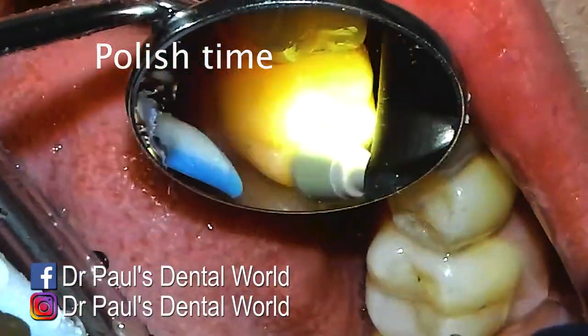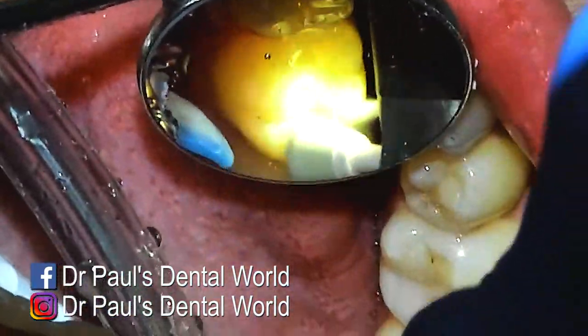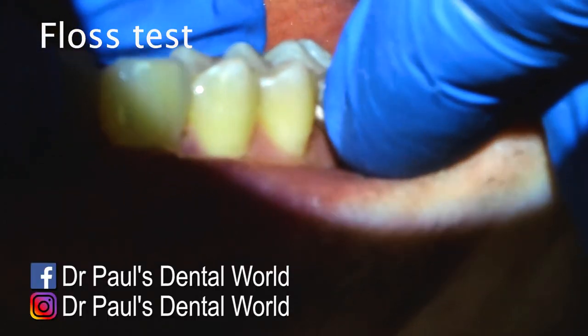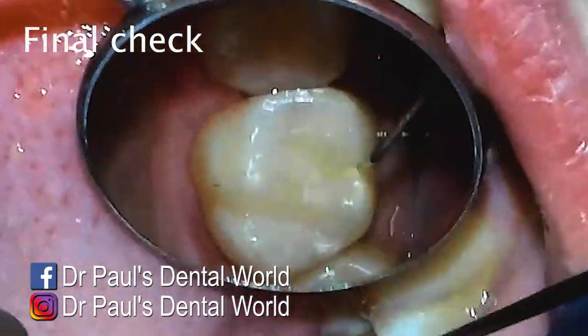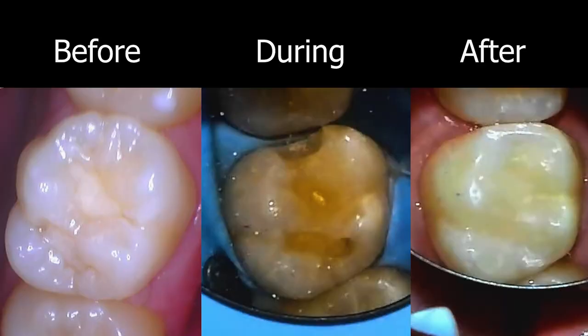To polish, I'll use a composite polisher — it doesn't really matter which one you use, but just make sure you go on different bumps and grooves and angles to polish it all. Then I'll check with floss — really tight contact, which I'm happy with — and go around with my explorer to make sure there aren't any areas that are catching. Everywhere feels smooth, so this filling is now done. Looking at the before, during, and after — the old filling wasn't very good. We've taken it out, cleaned out the decay, and filled it aiming to replicate what the original tooth structure would have looked like.